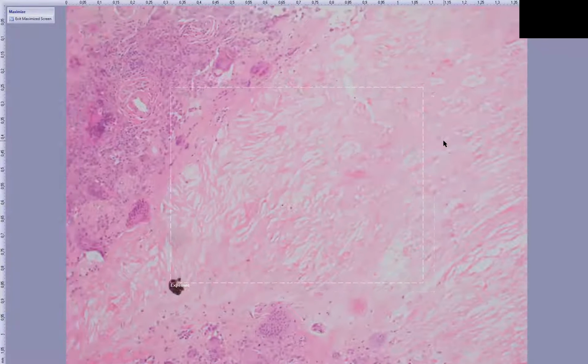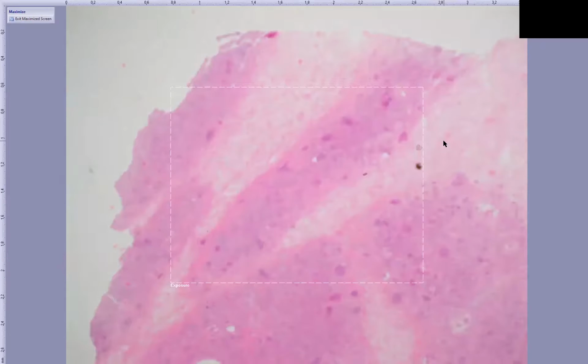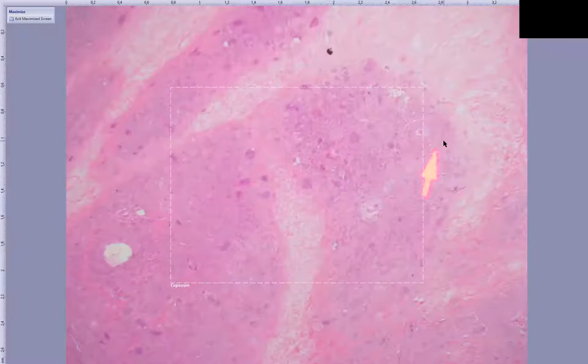You'll notice that we don't have a nicely circumscribed histiocytic infiltrate. Rather, the histiocytic infiltrate is organized as these bands, almost like a palisade. But when you look at the zones of necrobiosis, you can see that they kind of intersect a little bit at acute angles.